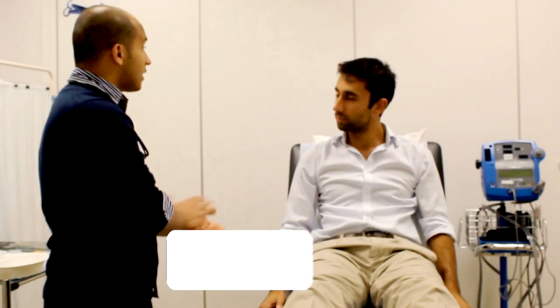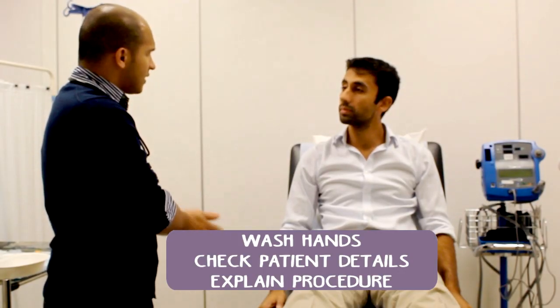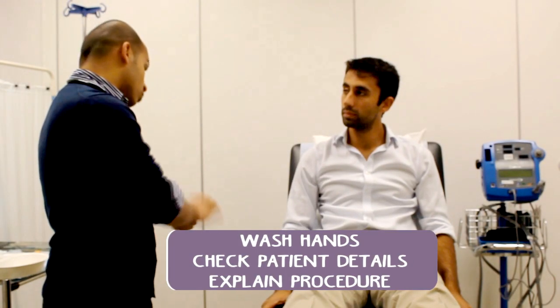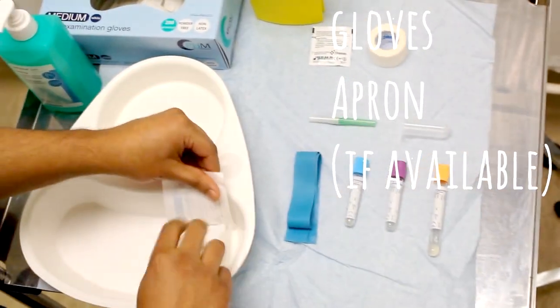On to the introduction. It's important to have a nice, slick introduction where you explain who you are, what you have come to do, the fact that it can be painful — you can say it can feel like a sharp scratch — and then to gain consent and to check the patient's details. A good tip is to ask the patient where people have taken blood from before and have been successful. This saves you a bit of time looking around.